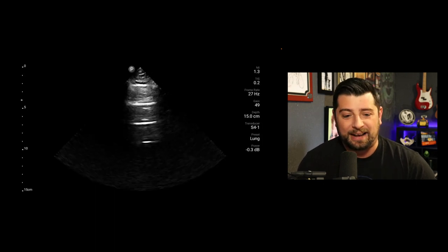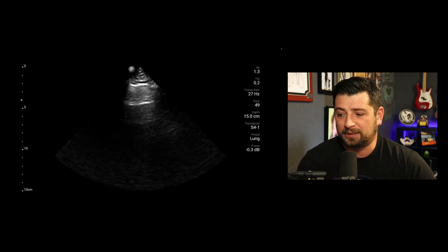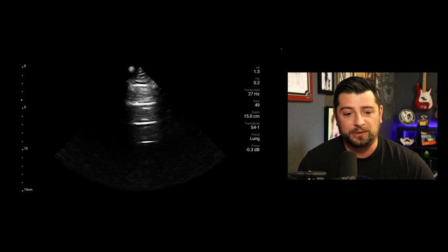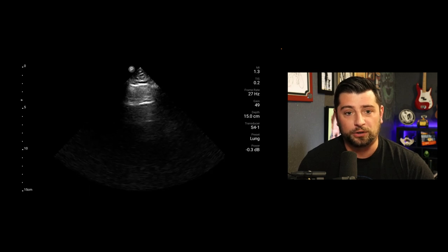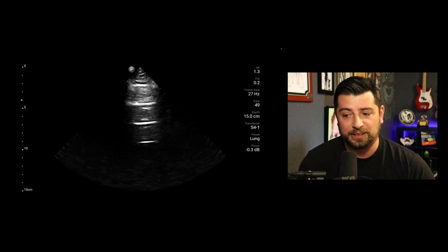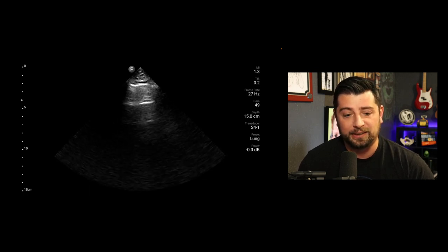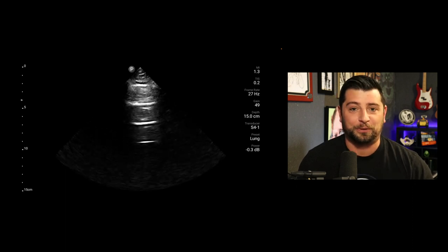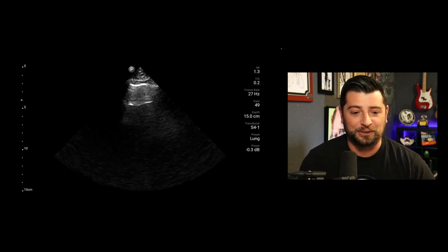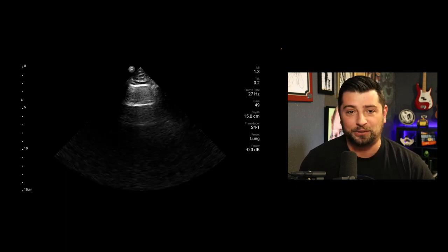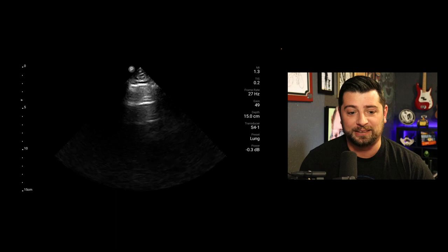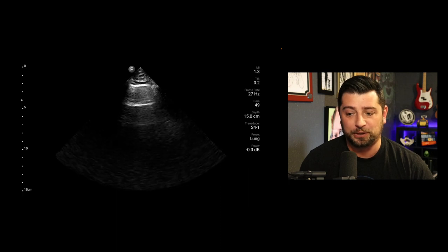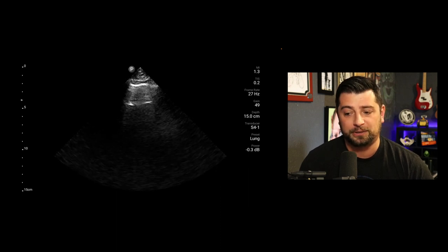You probably don't even have to, but I still would look at the lungs just to see what they look like — to see if I can spot any fluid — just to complete the entire assessment.